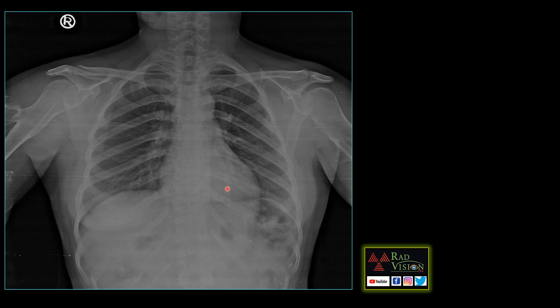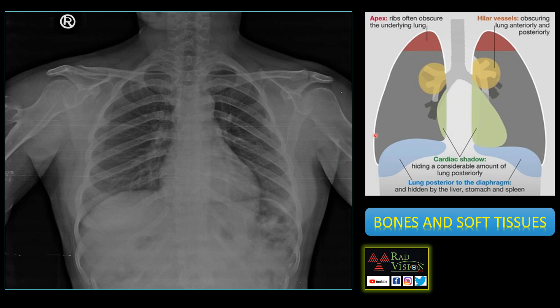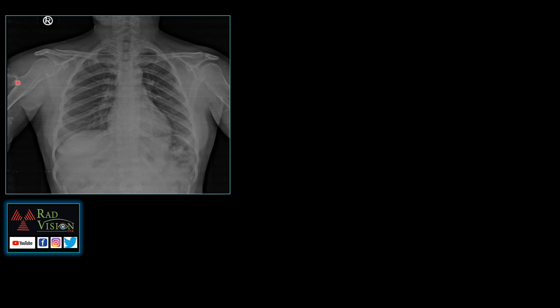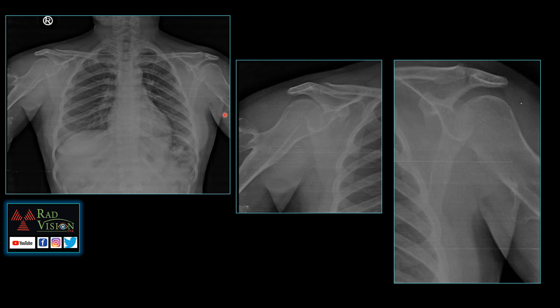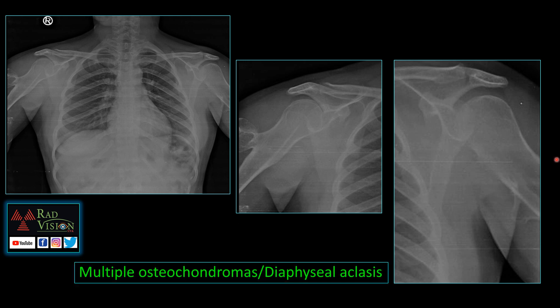Next case: this patient came for a routine PAC checkup. You can see there is clearly an osteochondroma arising from the humerus on the right side. When you diagnose this as a single osteochondroma, try to see in a detailed fashion — concentrate on the apices, hila, retrocardiac zones, bones and soft tissues. Looking again at the radiograph, this is the osteochondroma on the right side, but when you examine the other side of the humerus you can see there is a sessile osteochondroma there too. So this is not a single osteochondroma — there are multiple osteochondromas. These subtle findings completely change the diagnosis to multiple osteochondromas or diaphyseal aclasis.